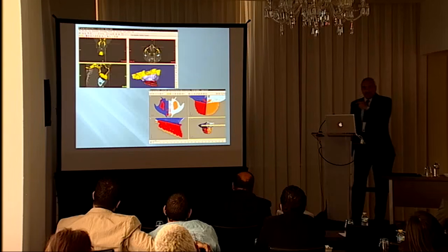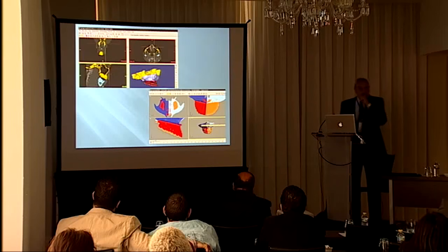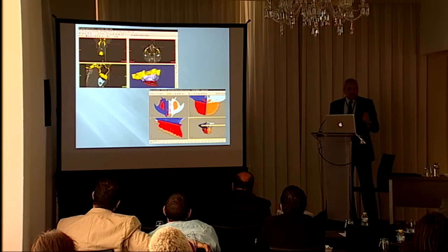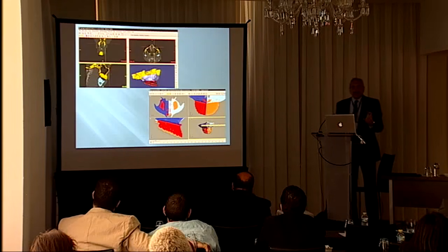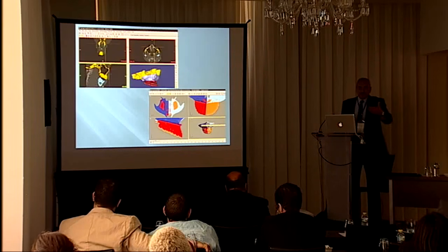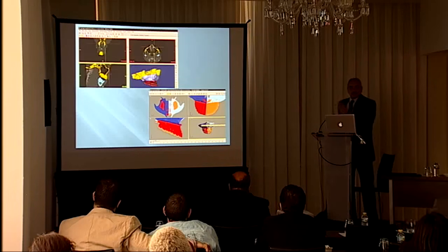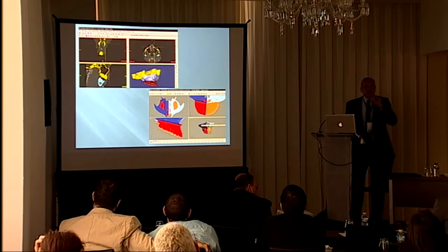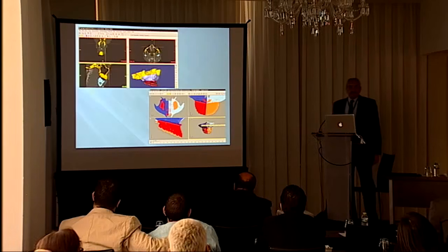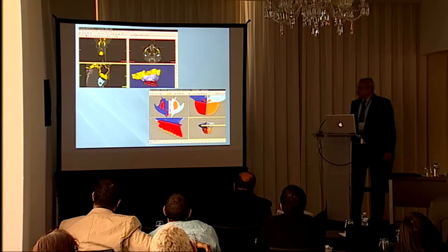And by the way, that was, I don't remember the date exactly now, the first computer-guided splint to guide the maxilla in impaction position. We had splints before that one that guide the maxilla forwards, backwards, guide the maxilla tilting, rotating right and left, but there was no computer-guided splint that guides the maxilla in impaction or in vertical position before that one.